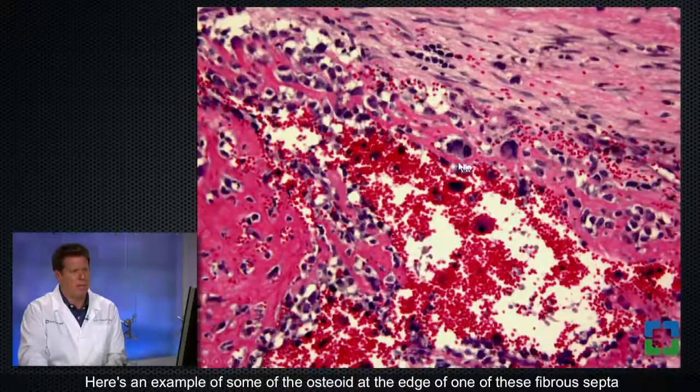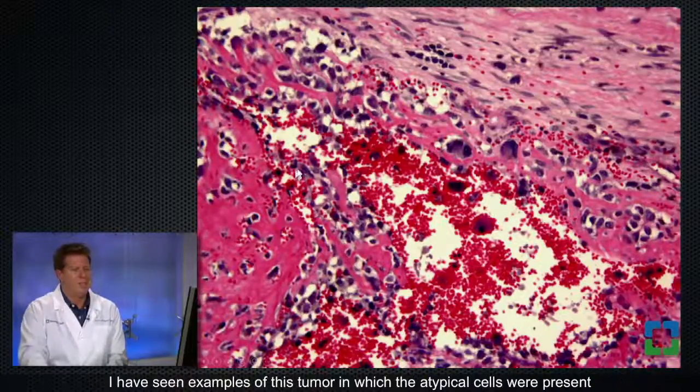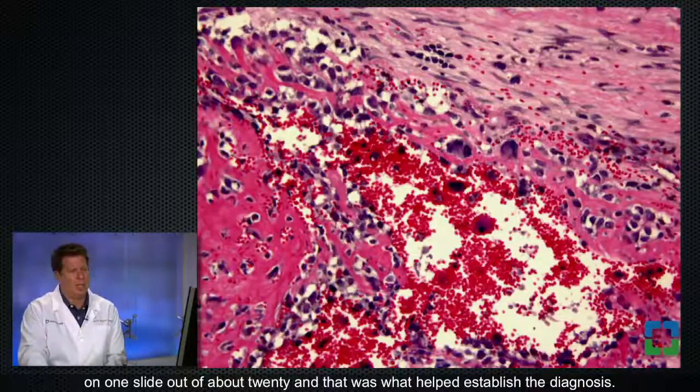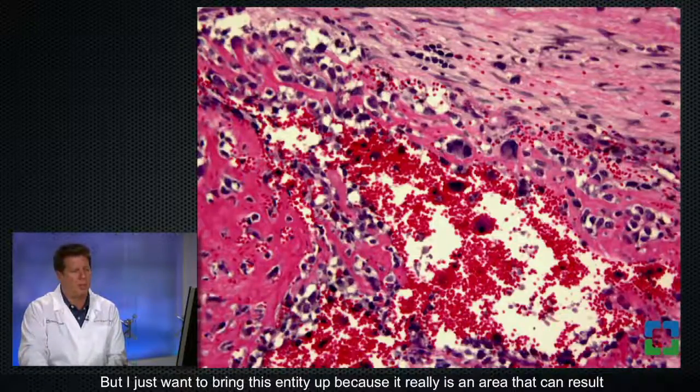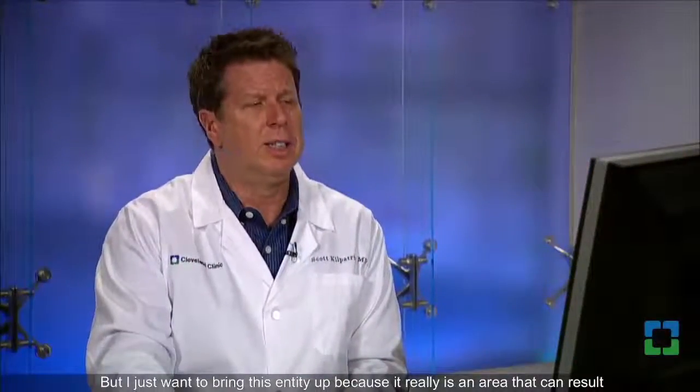Here's an example of some of the osteoid at the edge of one of these fibrous septa that's being produced by the malignant cells. But again, very atypical cells are present. I have seen examples of this tumor in which the atypical cells were present on one slide out of about 20, and that was what helped establish the diagnosis. But I just want to bring this entity up because it really is an area that can result in a medical legal challenge.